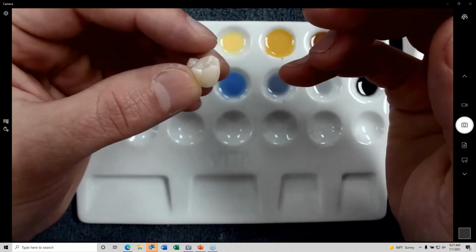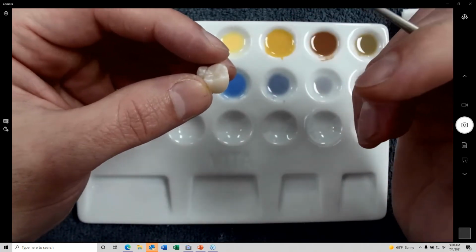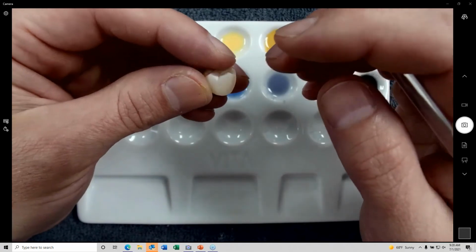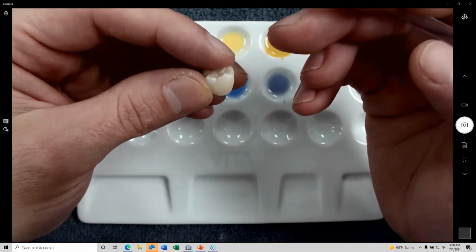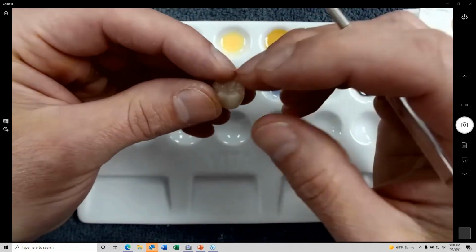Secondarily would be to stain and glaze. A glaze layer is nice and smooth, so it will not wear the opposing dentition, but you have to remember that all stain and glazes do wear after time, and so you want to be careful of that.